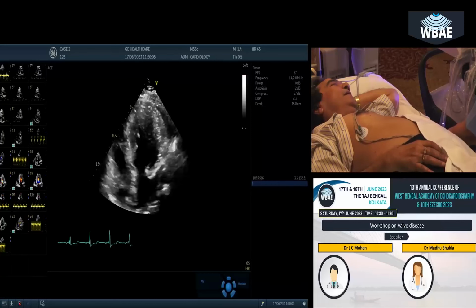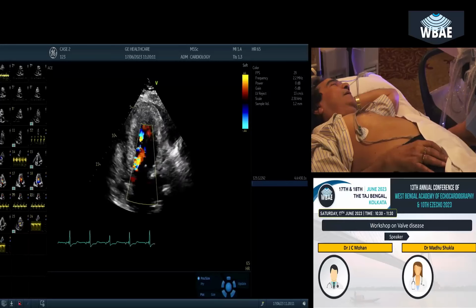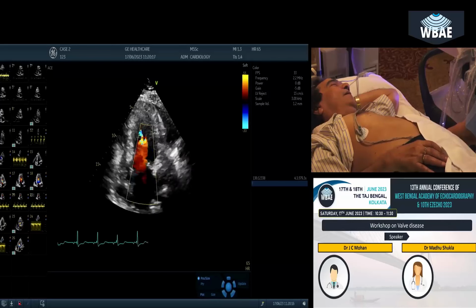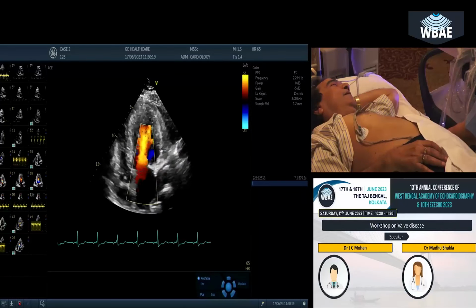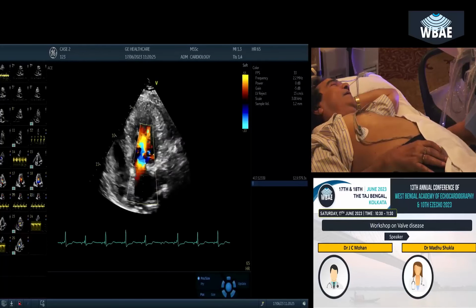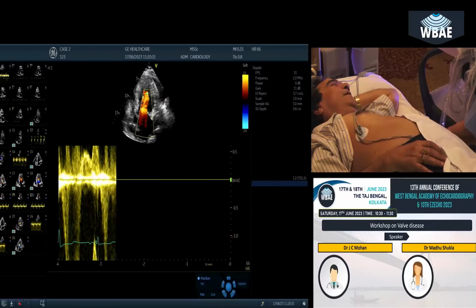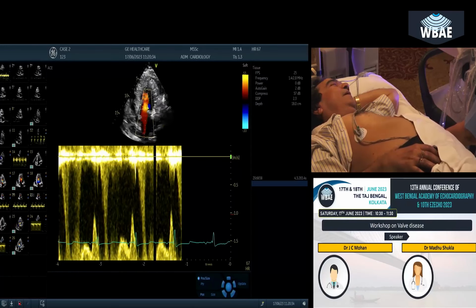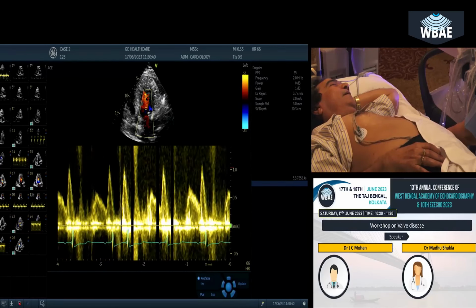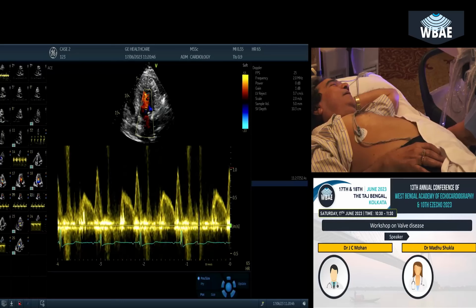So there is hardly any mitral regurgitation. But in the isovolumic relaxation phase, you can see some jet of MR. Yes, you can see a little bit of that. Can you put the pulse Doppler again there? Not the CW, pulse Doppler in the LVOT. Same view? Put it just at the AML level. Okay. And bring down the... Okay, now you can put the same place CW.